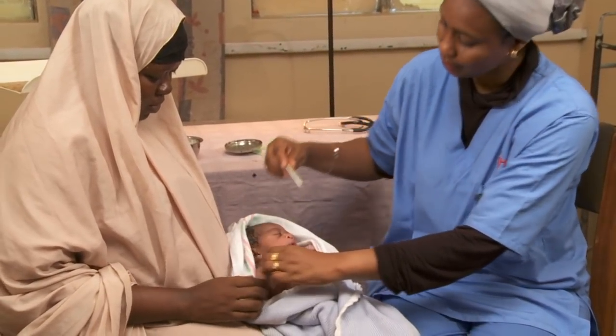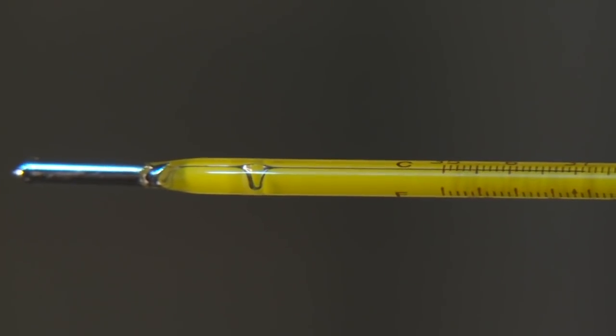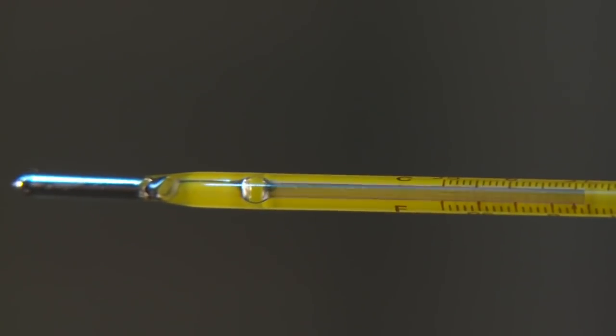Read the number at the top of the line. Some thermometers will need to be rolled until you see the line.